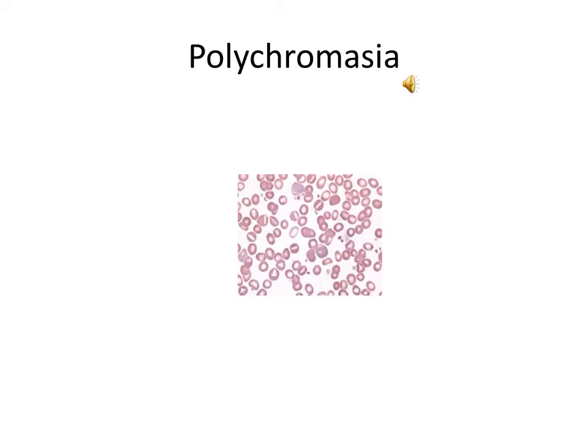It's the result of residual RNA, and these are actually called reticulocytes when we do a special stain on them, and we can actually stain the reticulum. But without the special stain, we do not call them reticulocytes, we call them polychromatophilic red blood cells. And again, the picture of polychromasia.